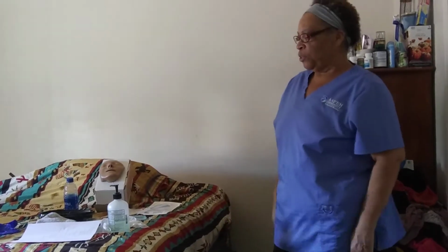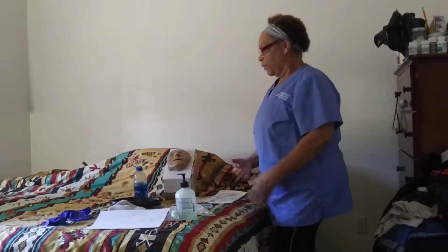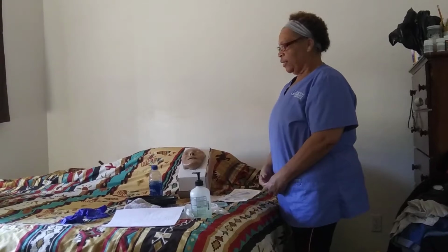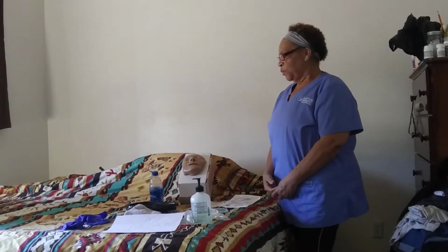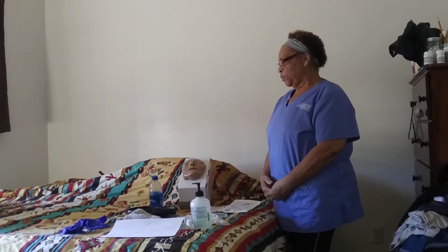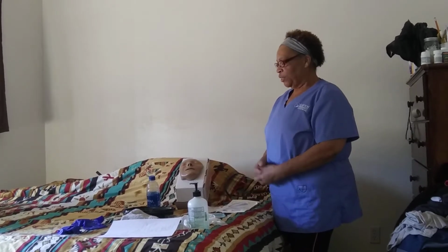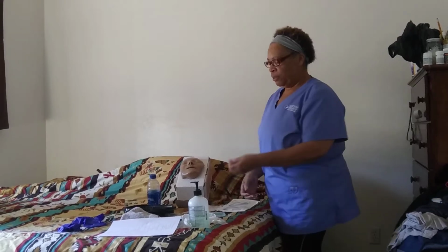I'd go into the patient's room, provide privacy, introduce myself. Hi, I'm Pauline. I'm here to insert an NG tube. I need to identify the patient with two patient identifiers by asking him his name. What is your name, sir? Harry Jones. Harry Jones, what is your date of birth? 1555.